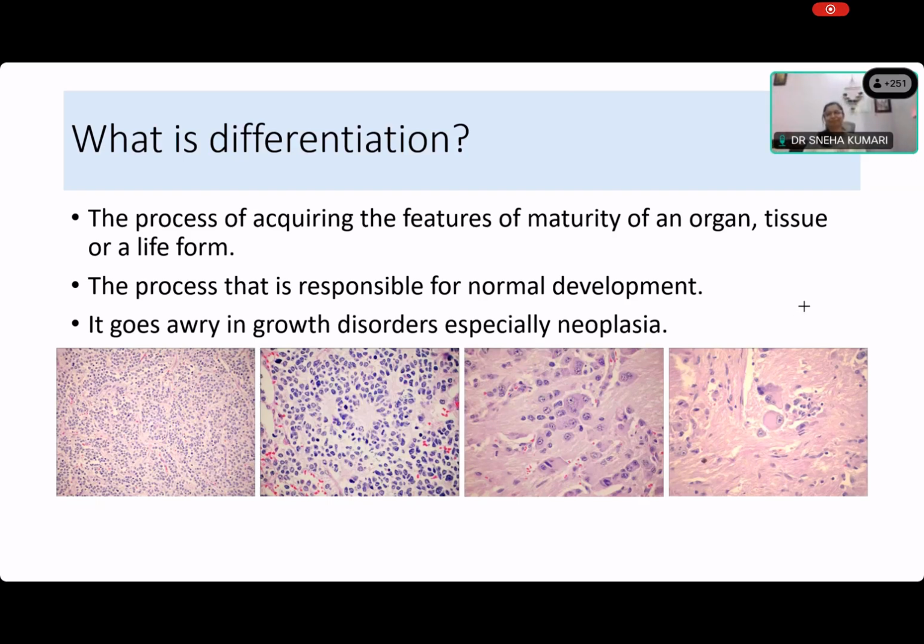Okay. All right. So get this now. We are talking about differentiation. I thought that I've got so few slides and we'll finish in no time at all. But we're stuck on the first slide itself, and that is what is differentiation. Let's go on. I have to get rid of this annotation. Stop annotation.